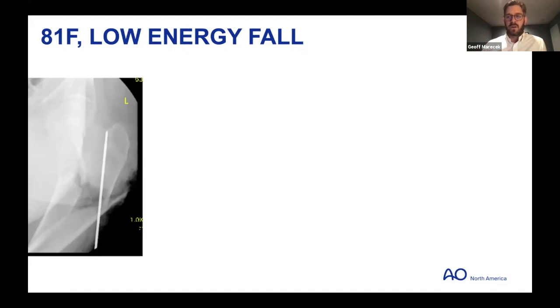And so your alignment could be all over the place. If you get this reduced and you just put a thoughtful cerclage wire, or you get the bone to contact, then you're going to have a lot of inherent stability that your nail can support. And so you're much more likely to be successful in terms of taking it to union without problems in alignment than if you just get it close enough, or it seems to be okay.